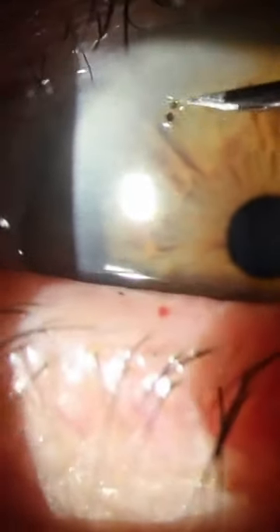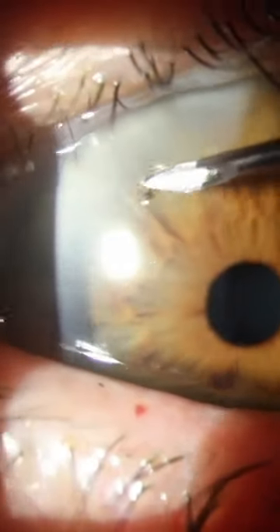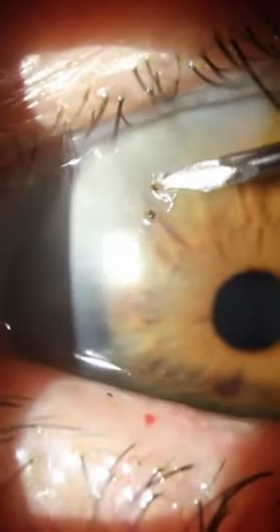A lot of these foreign bodies are sharp metal objects. It's important to have previously ruled out a penetrating injury in all of these patients, as that would obviously be a significantly more invasive procedure to have removed and will often require a vitrectomy.